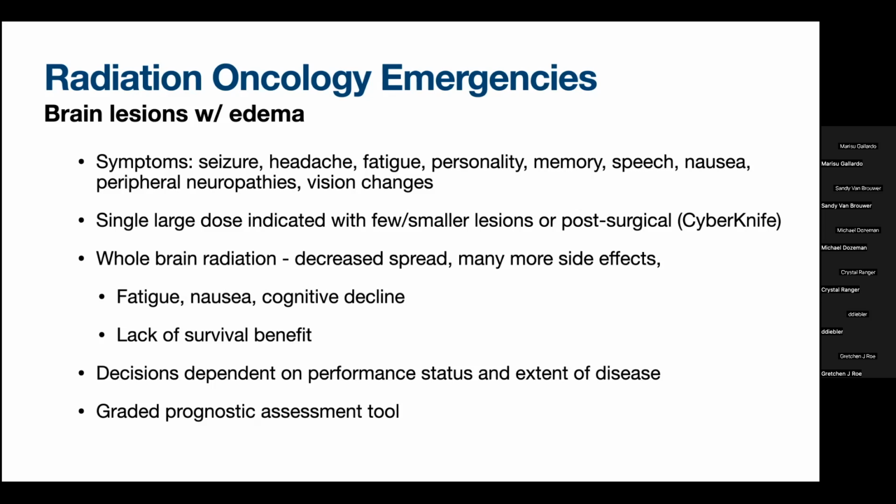And that's where that CyberKnife, one of the branded treatments, ends up coming into play, is that they can have a very precise delivery to a tumor, especially if it is well-defined or a single lesion. Post-surgically, or even before that, if the patient's functional status does not allow. There is some description of whole brain radiation. The guidelines that I was taking a look at didn't really seem to support that idea all that strongly.